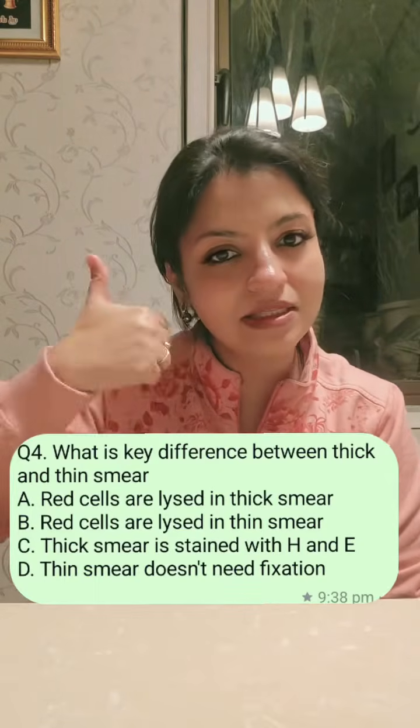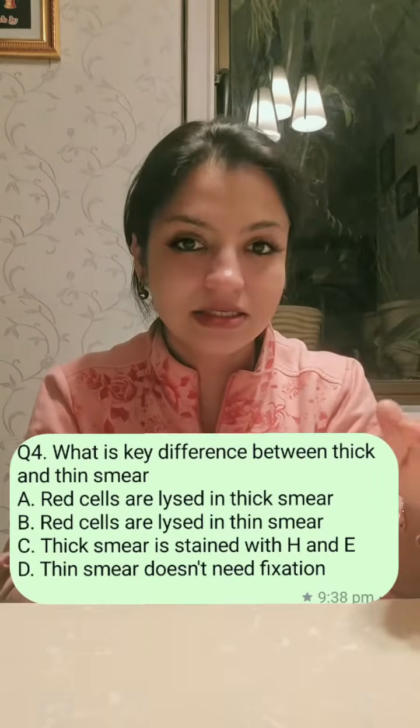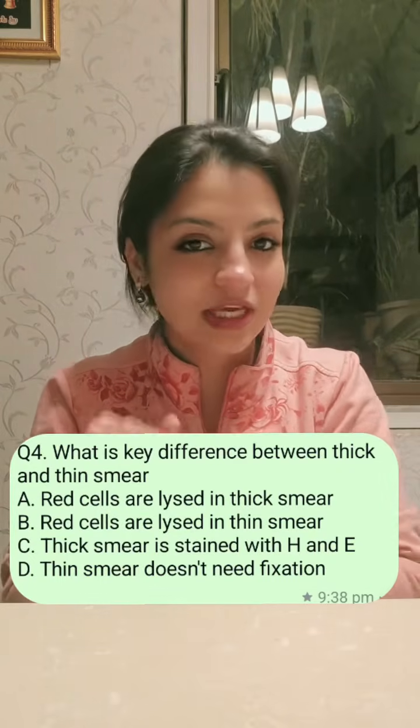So I hope everybody can answer this question now. You know that in a thick smear, the red cells are lysed. So that is the importance of thick and thin smear.